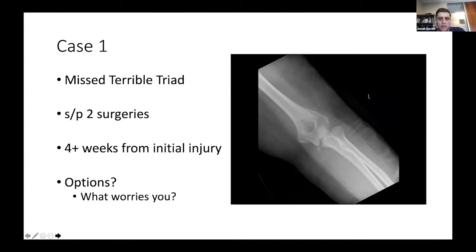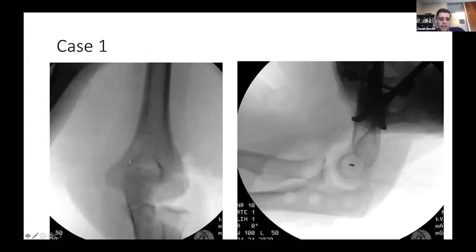So that's it. So let me show you what was done. So here is a fluoroscopy with it reduced. So first things first is when you have these sort of chronic or semi-chronic fracture dislocations, the problem is getting it reduced takes time. Greg alluded to it. You have to actually do a capsular release, an elbow release, prior to getting the elbow back in. So you're actually destabilizing it first to get it back in, then you can get it reduced, and then you got to build back up from the ground up. And I think that's really quite challenging.